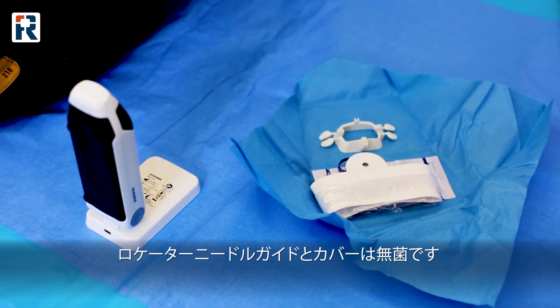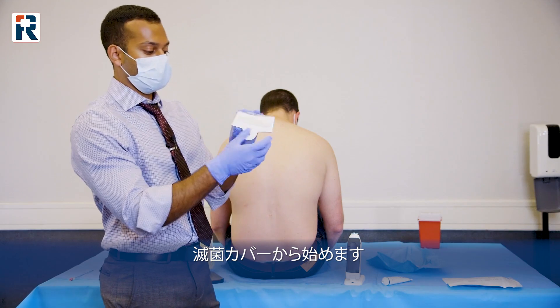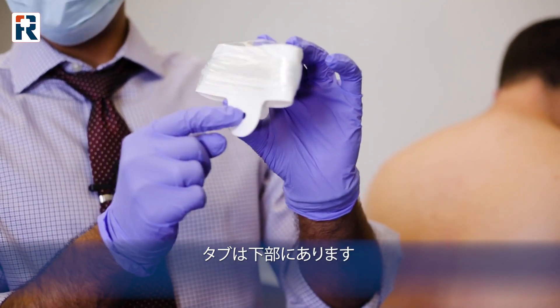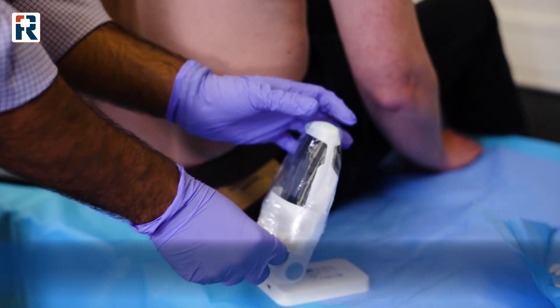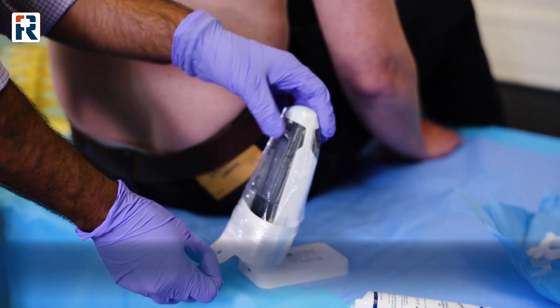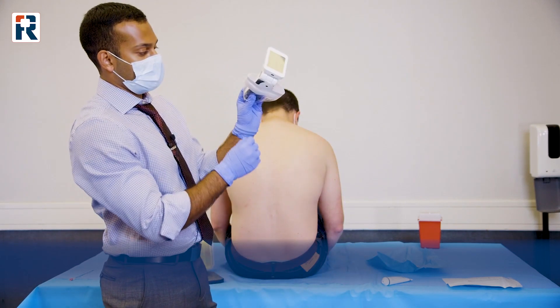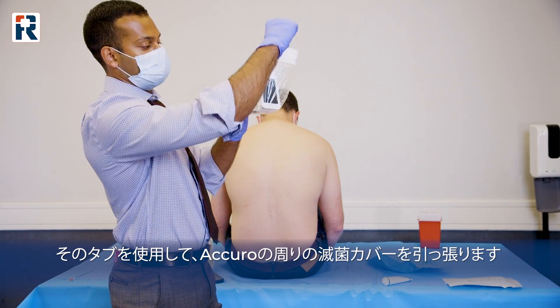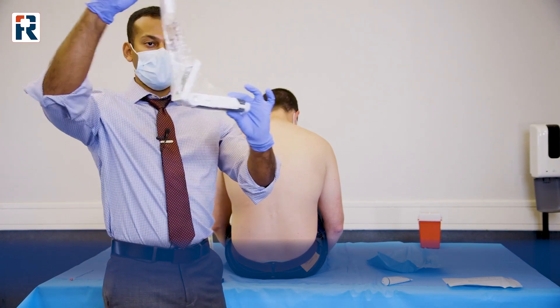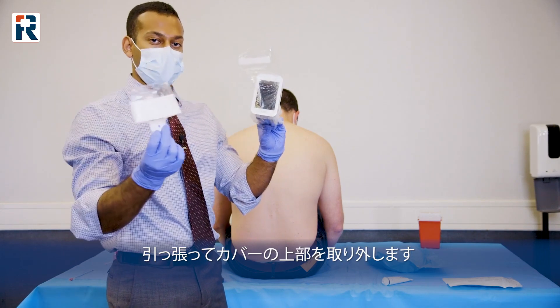Inside your kit, you're going to have a few different things. The first thing you're going to want to take is this — this is our cover. The most important thing is you want to have this facing down. Place this over the probe. You're going to hold on to this tab, then grab the top end, which is going to be your covered portion, and grab just the tab portion and pull it around. This is going to form a film over this. You're then just going to pull the tab and it's going to rip just the top portion.